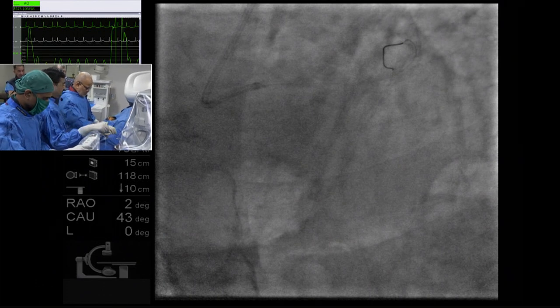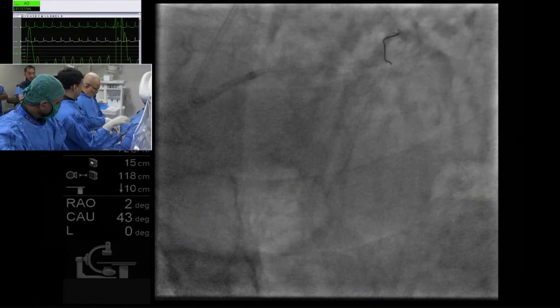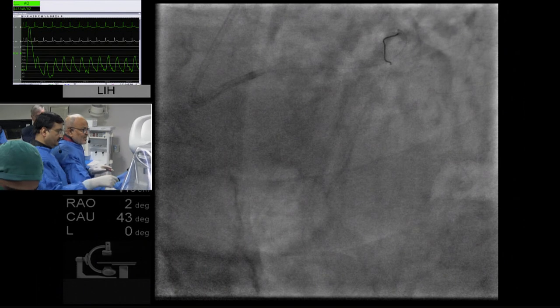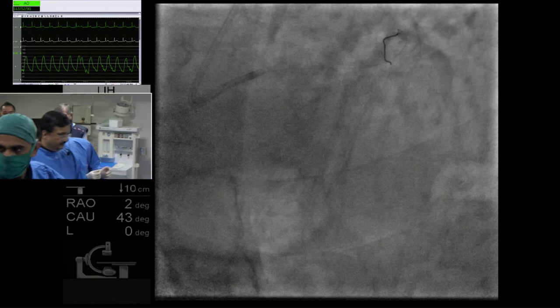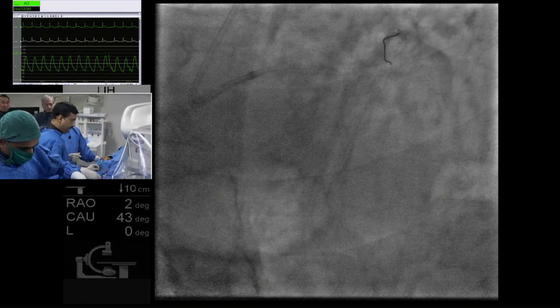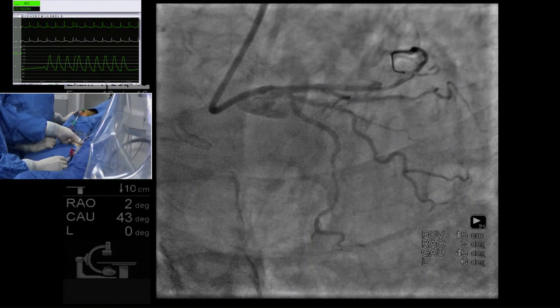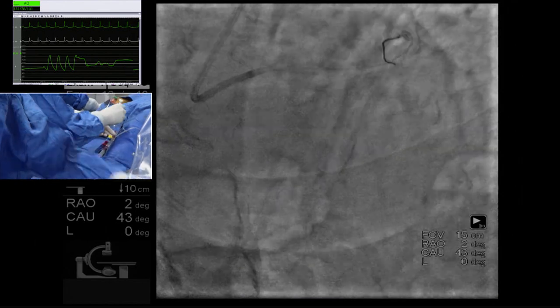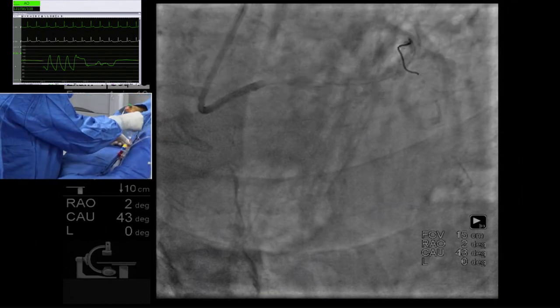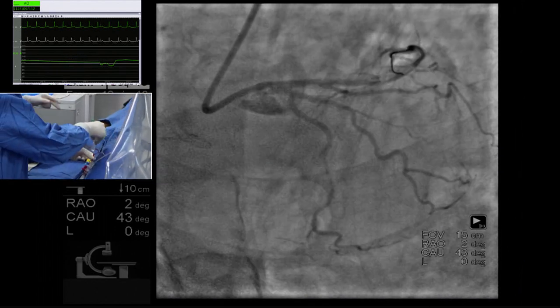Any plan for rota in the proximal lesion, Tejasbhai? I'm not sure. No, I will not do that because I see dissection there. It can close the artery. Inject. So it looks okay. Yeah, there's a dissection in the middle part, right? Yeah, or some filling defect. There could be a calcific nodule in that region, which is preventing that part of the catheter. The head is hitting there.